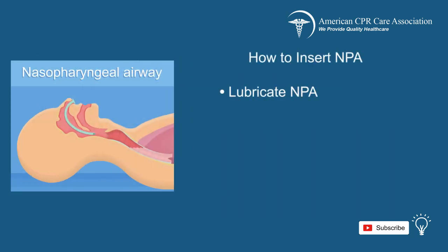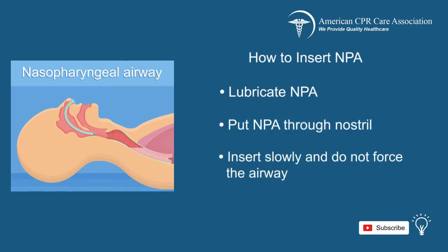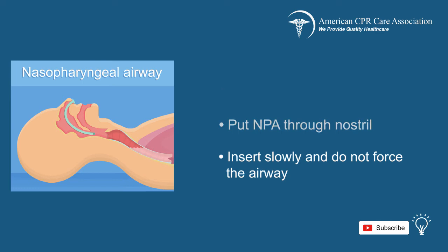Lubricate the NPA when possible. Put the airway through the nostril slowly, moving in a backwards direction down toward the floor of the nasopharynx rather than upwards. Be careful when inserting the airway as it can irritate the mucosa or lacerate the tissue, and do not force the device.